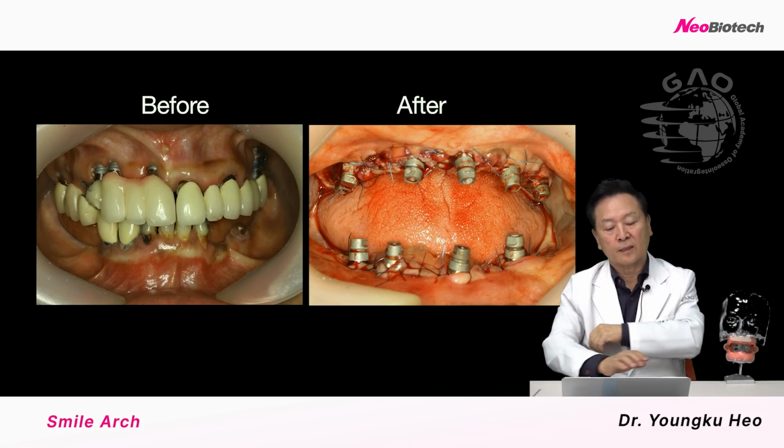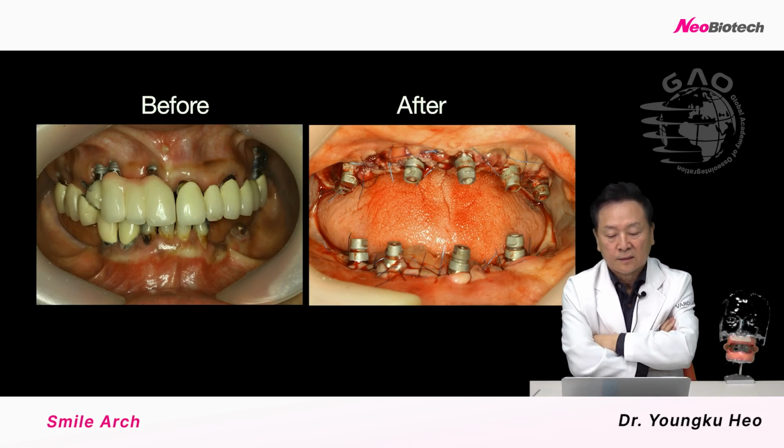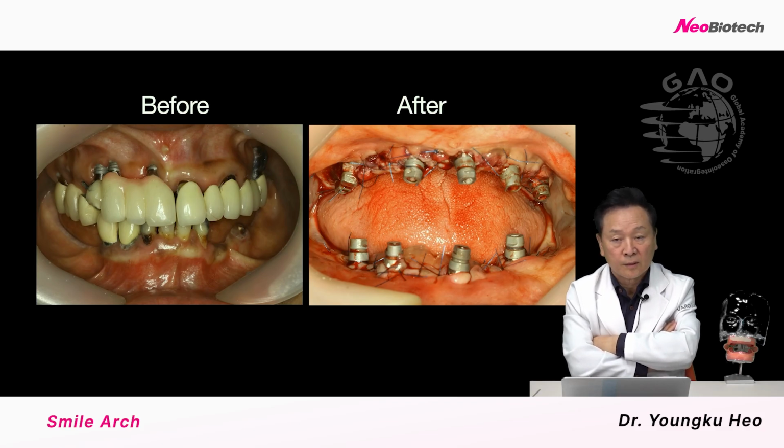So from the left side, on the same day, we can place that kind of implants.